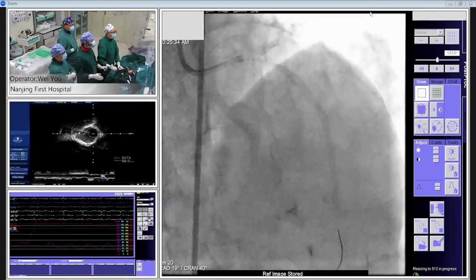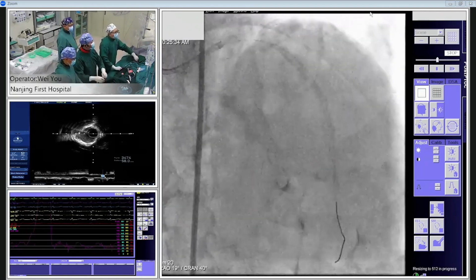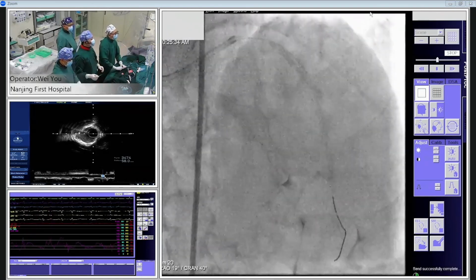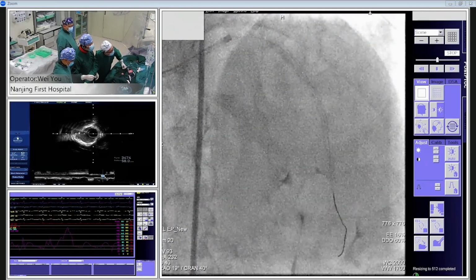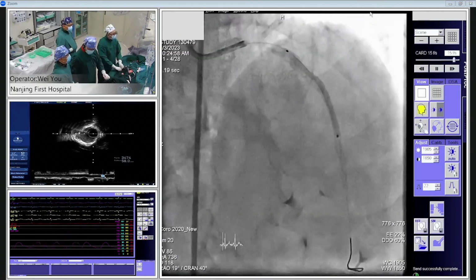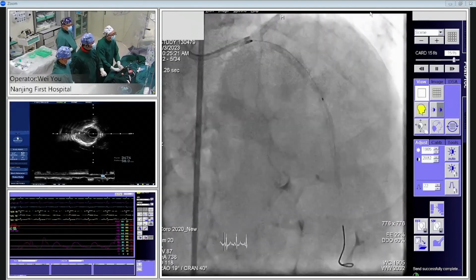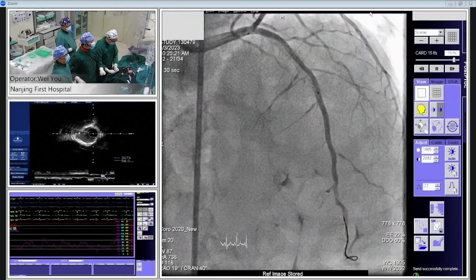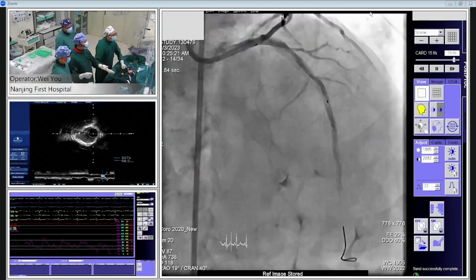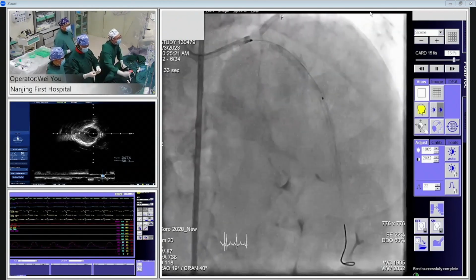Before that, chief, do we need cutting or NSE to prepare the proximal lesion? Because I think we should, because the stent does not expand well for the proximal segment. What was the inflation atmosphere of the previous 2.5 NC balloon? 16.